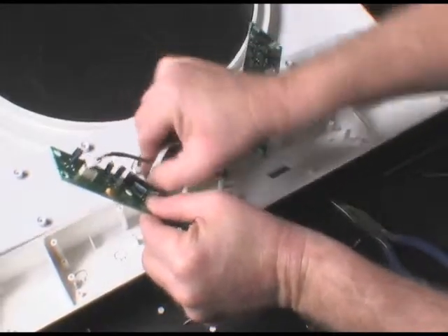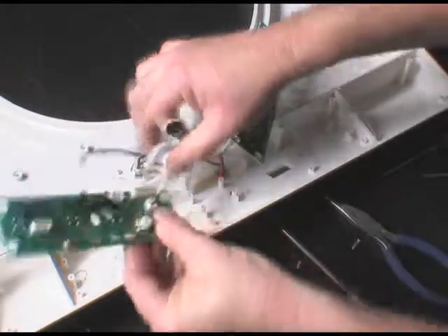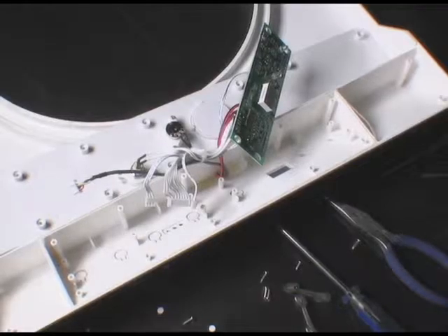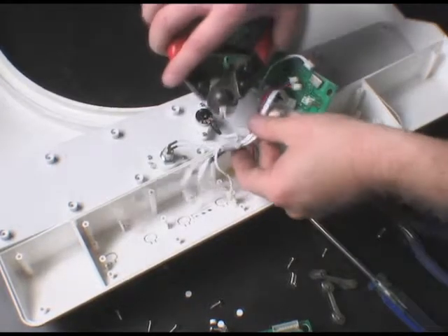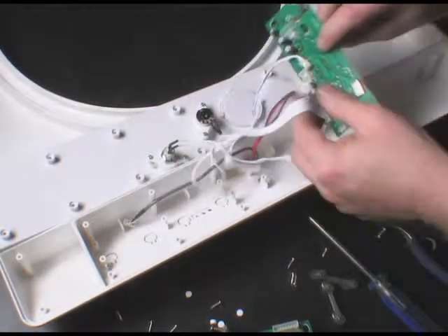Next, gently unplug the wiring harness connectors, making a note of the receptacle locators of each connector. Refer to the installation diagrams for proper connecting points. The wiring harnesses of the two boards are secured together in the middle by a tie wrap. Gently cut the tie wrap and separate the boards.